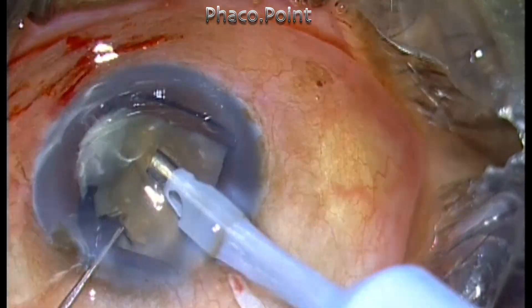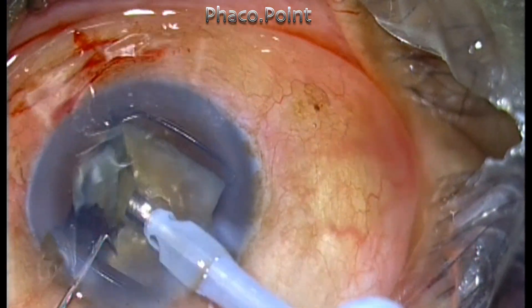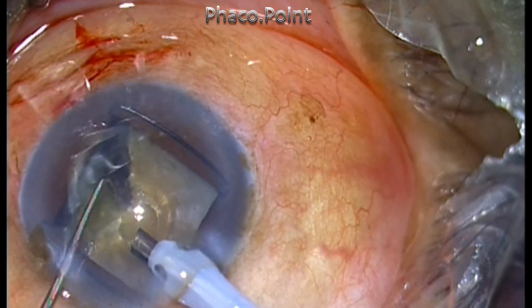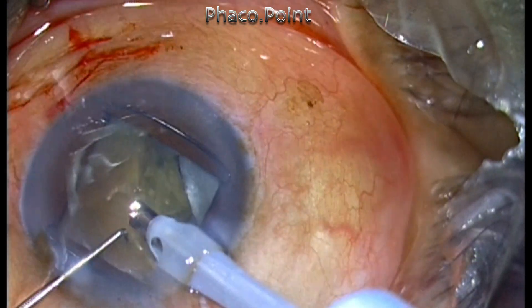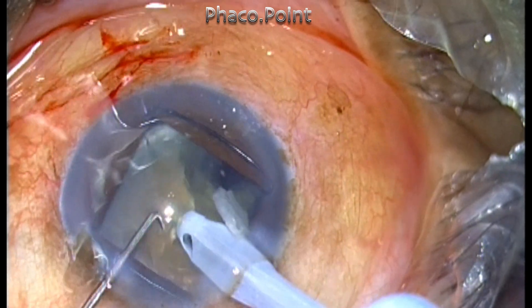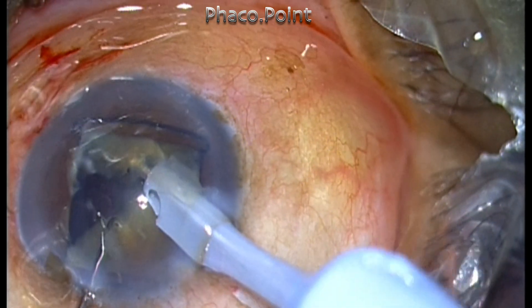While the piece is being emulsified, I find that a bit of it is still sticking to the posterior plate. I don't try to remove it — I include it while removing the next piece. I create the chop, create the separation, and this time I make sure the separation goes through and through and the piece is completely free before I mobilize and emulsify it.